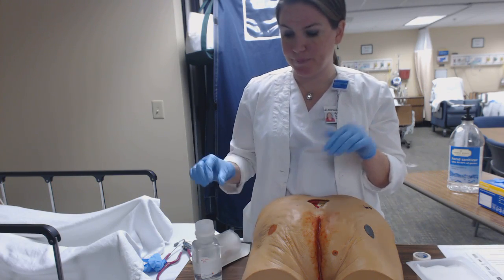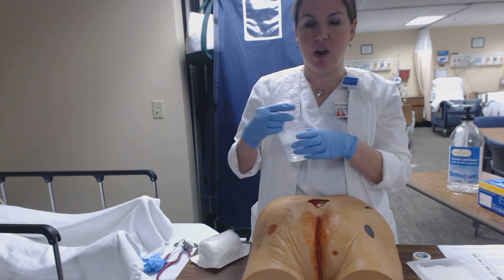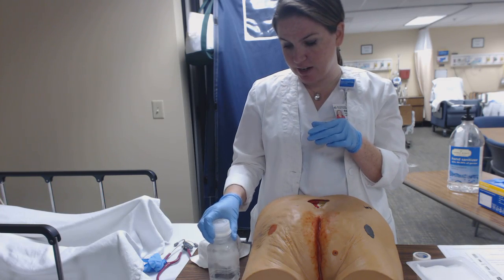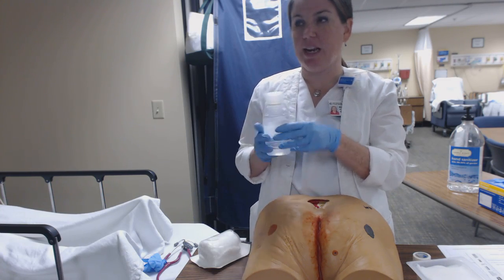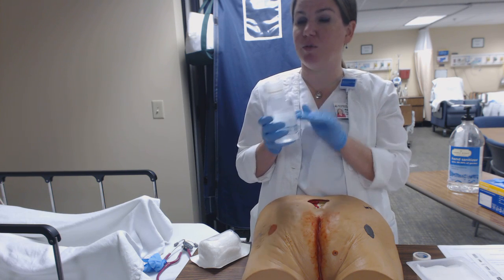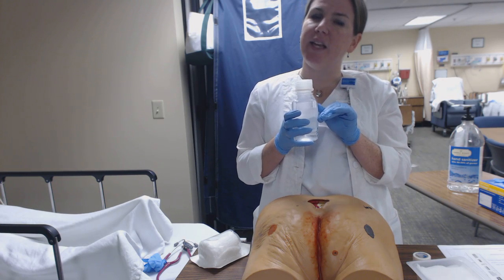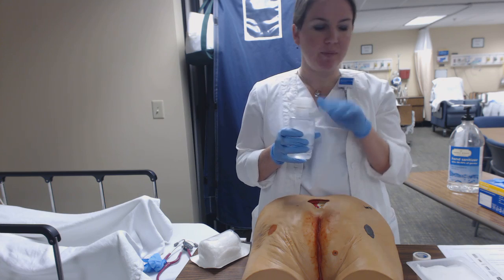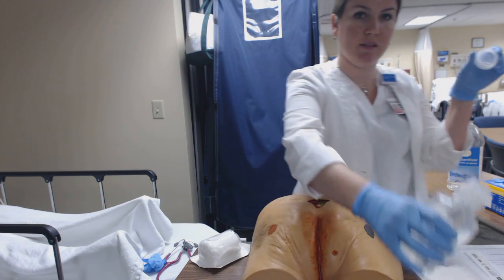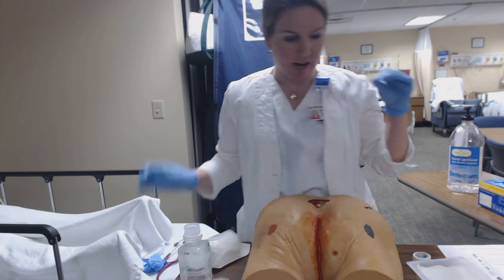That makes sense. So we have our irrigant here, which we would want to make sure has the right date and time on it, which it does. If it was new, we would date and time it, and it's only good for how long? I think it's 24 hours, didn't you say? I think you are correct, Miss Palmer. So if we're going to open a new one, we would lip it. So we're lipping it.